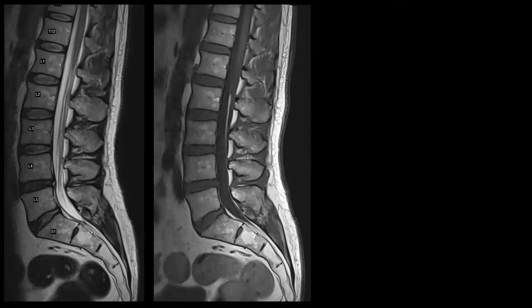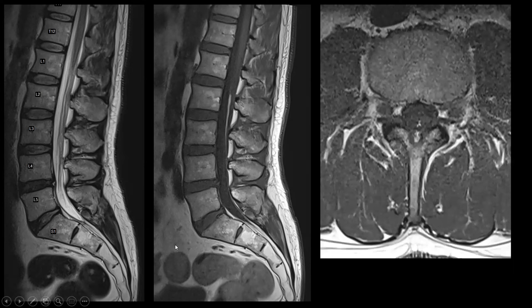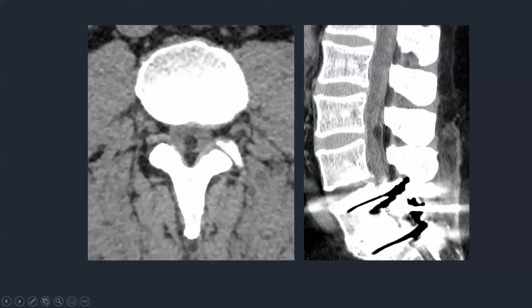Another example of a simple dysraphism is a lipoma of the filum terminale. On T2 weighted images you might see nothing out of the ordinary, but on fat-sensitive T1 weighted images a T1 hyperintense linear structure appears along the filum terminale. If you start looking for it you might see it quite often. This is generally an incidental finding on MRI studies of the spine, often without further consequences and not necessarily associated with tethered cord or other spinal dysraphisms. These can sometimes even be seen on CT.